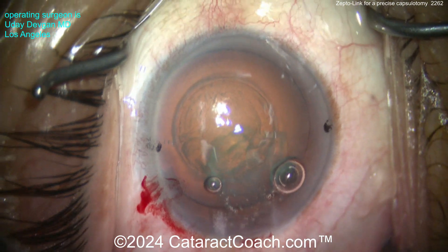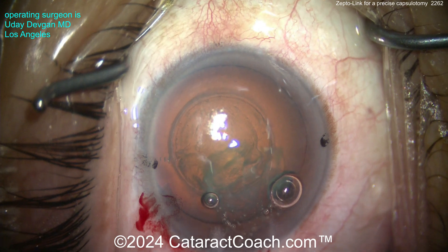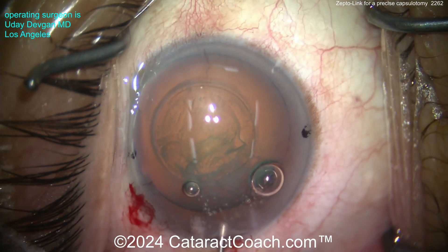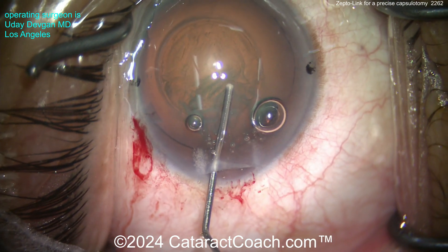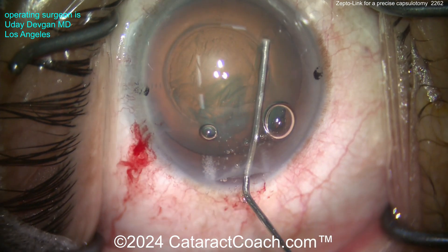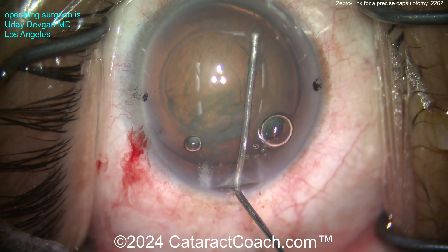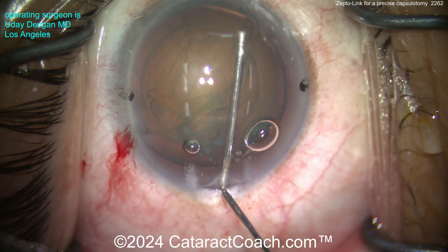There's the capsule tissue — I'll put it on top of the corner so you can see what it looks like. Let me show you the rest of the case unedited. The capsulotomy edges are rolled, so it's very strong. Here I'll do some hydrodissection, nice and easy.